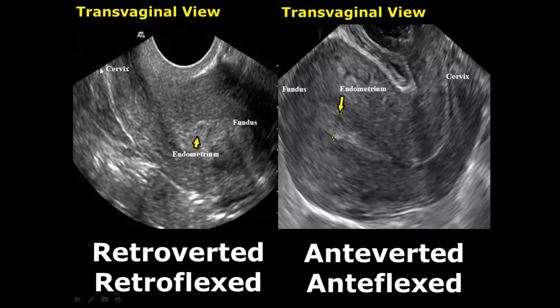The cervix is not very clear in this image, that's why we can use a combination of transabdominal and transvaginal views to determine the actual location of the uterus.